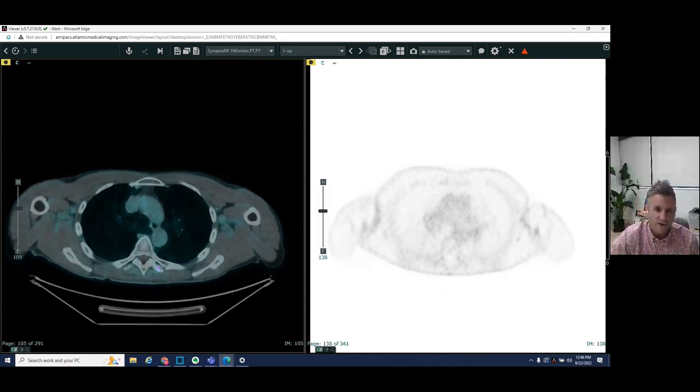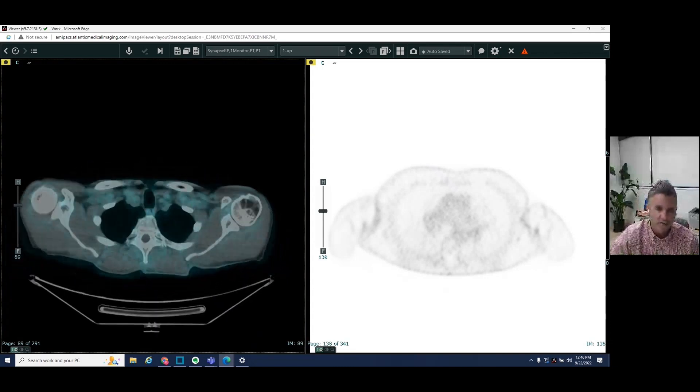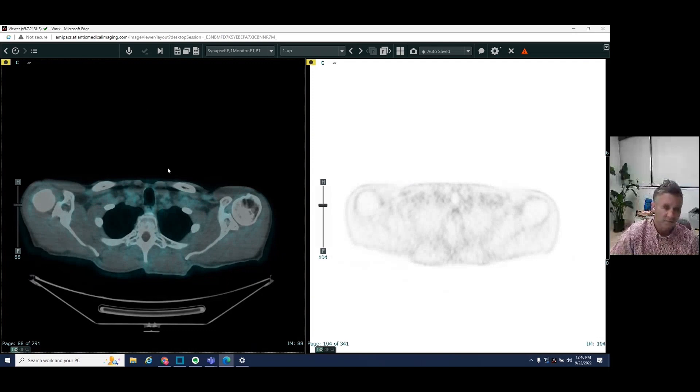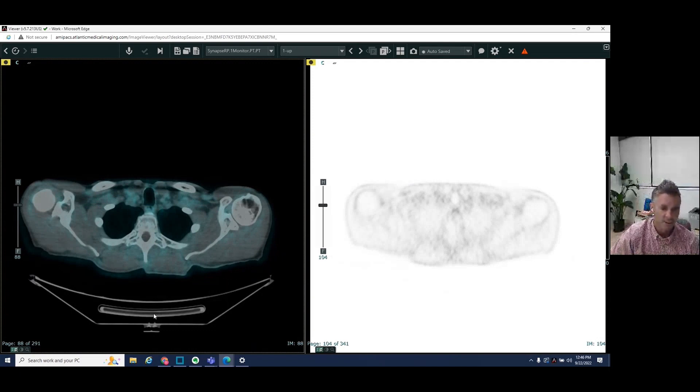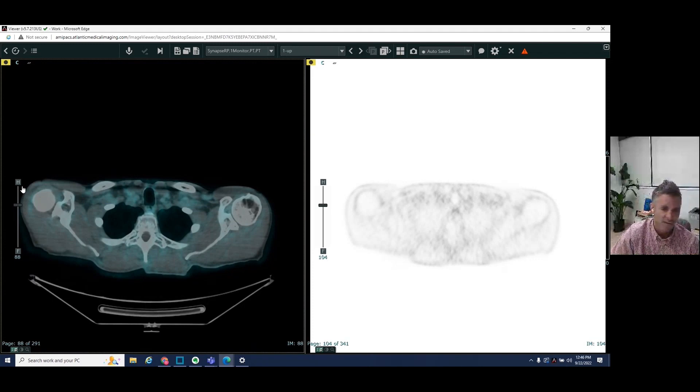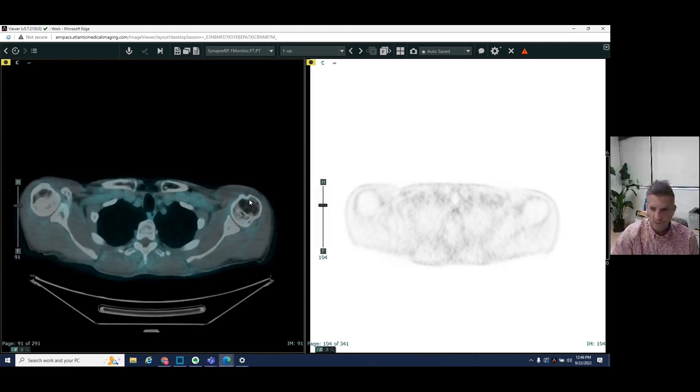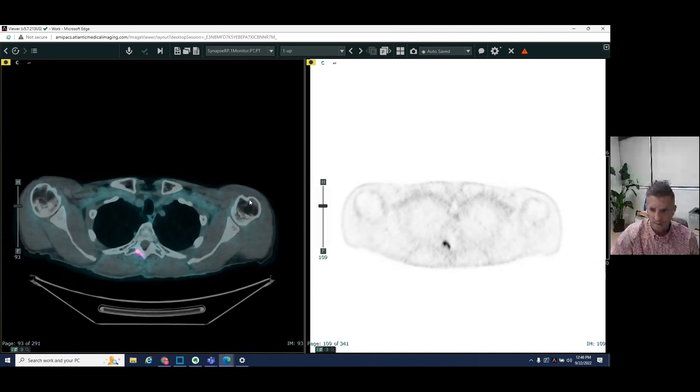So in this case, we're a little bit higher up here. Again, patient is lying down. This is the patient's front or anterior, posterior. This is the patient's back, right side, left side. And as we are scrolling down here, we see a few areas of increased uptake.